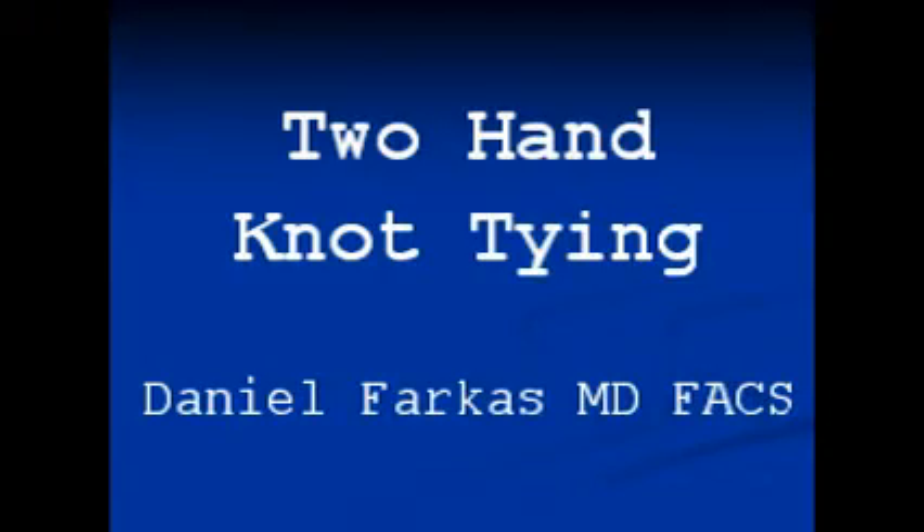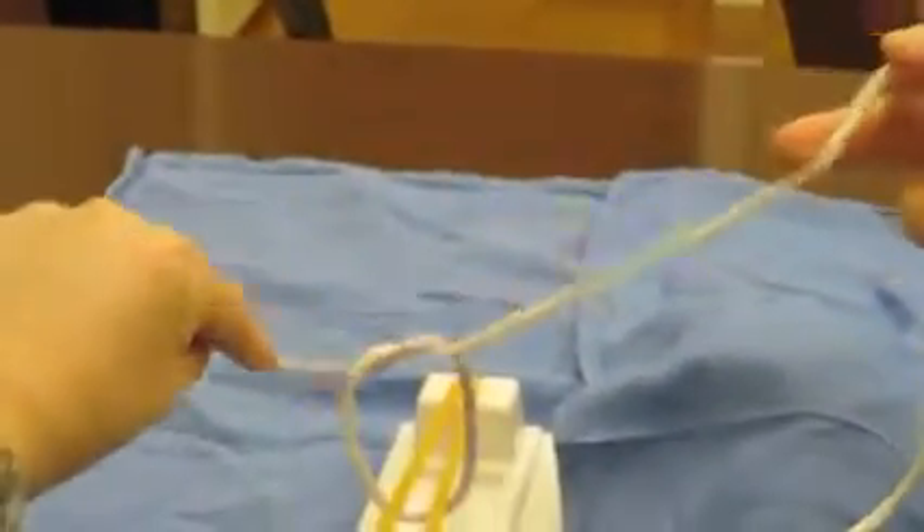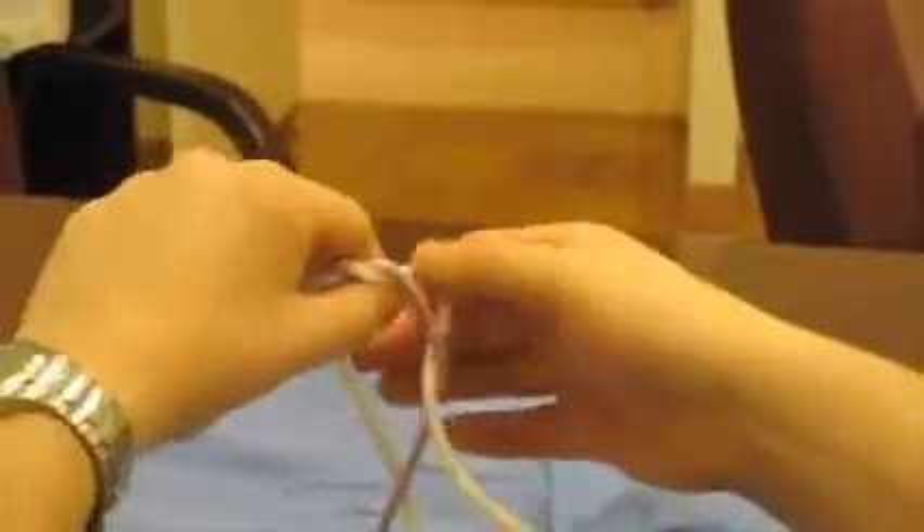Two-handed knot tying. Here we have the first throw where the white tail goes to the right. And here we have the second throw where the white tail gets brought through, but now comes back to the left.